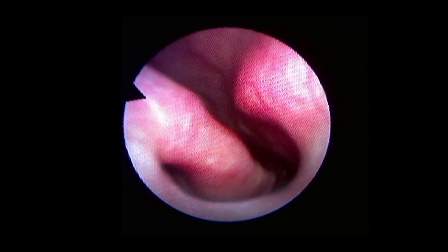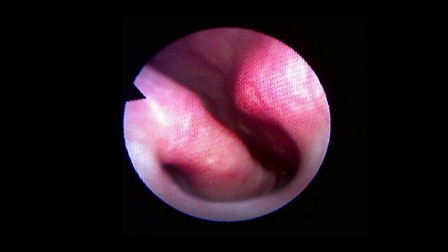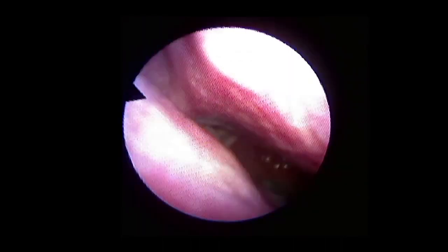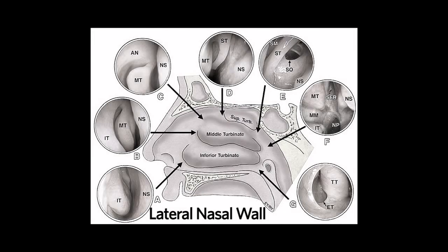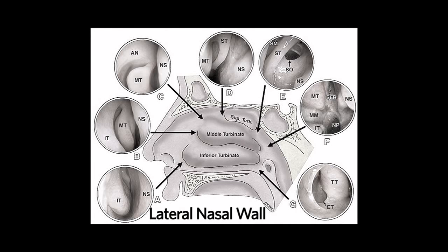As the flexible scope enters the right nasal cavity, one notices the nasal septum on the medial side and the inferior turbinate on the lateral side, and the middle turbinate on the lateral side. The lateral nasal wall is composed of the inferior, middle, and superior turbinates.